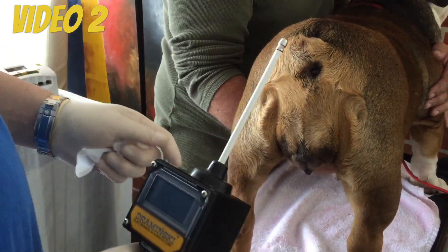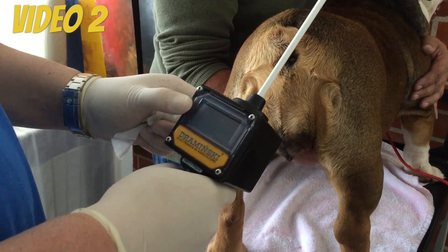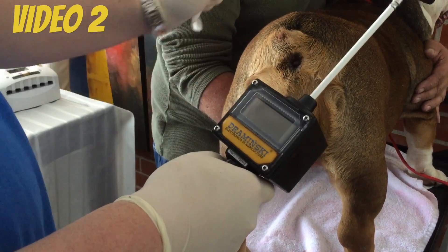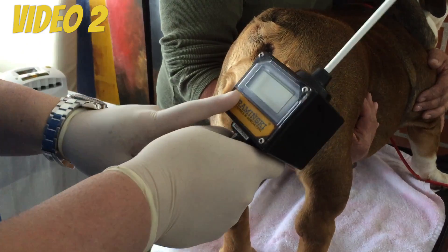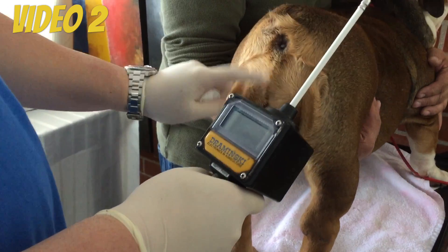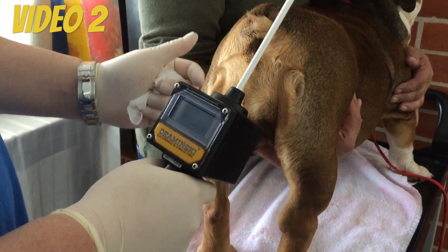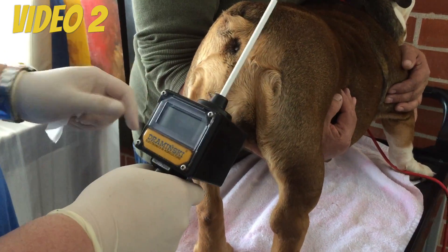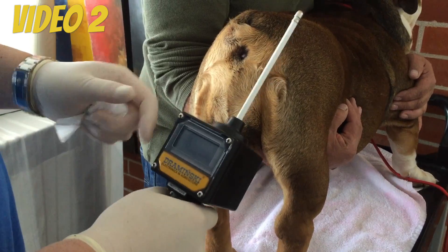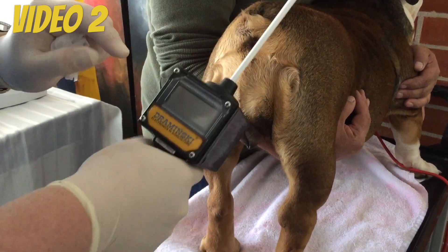Hello everyone, good day. Today is video number two of the series that I'm doing on testing this female that's in heat with the Draminsky ovulation detector. I'm also doing a vaginal cytology to see the cells and I'm also doing a progesterone test with a canine P4 analyzer at the same time. So we're going to see the results of each one of the methods and you guys be the judge.